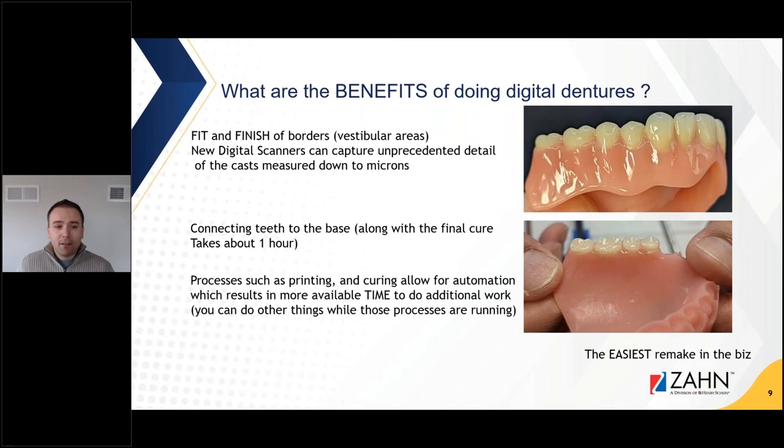Connecting the teeth to base along with the final cure takes about an hour, and processes such as printing and curing allow for automation, which results in more available time to do additional work.